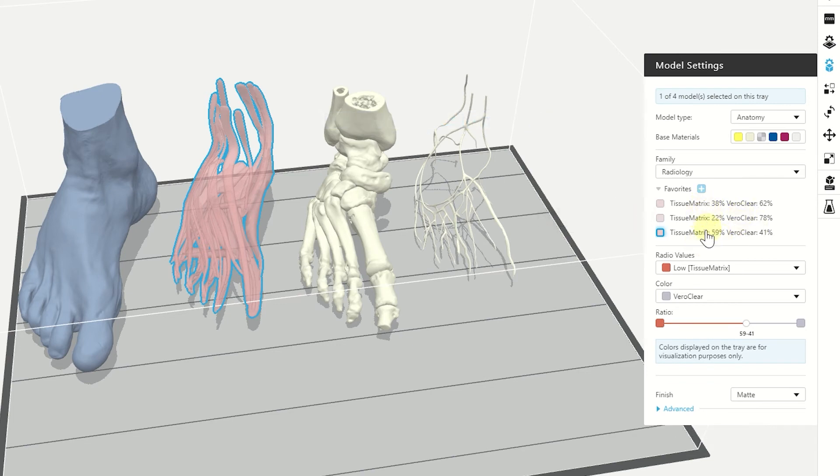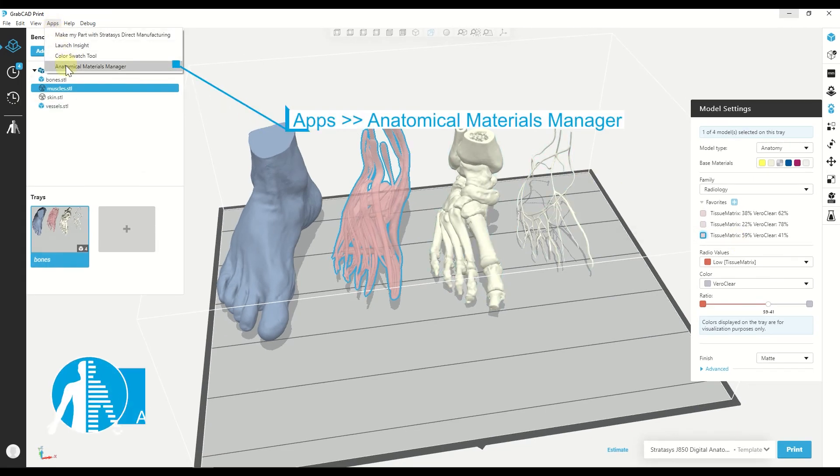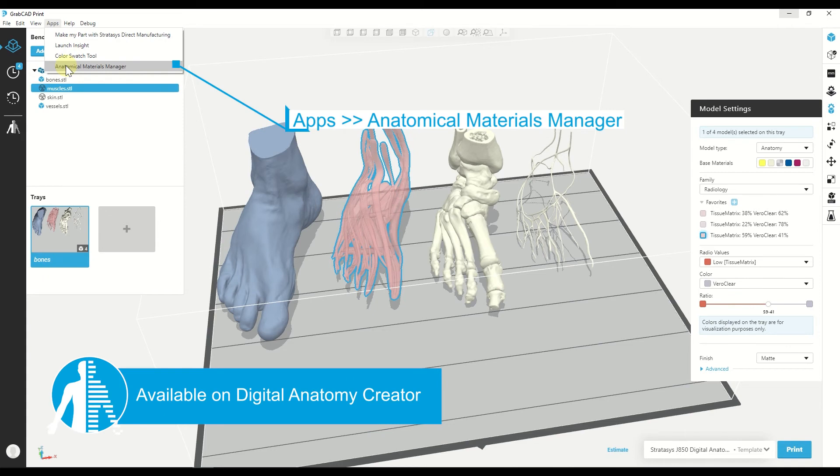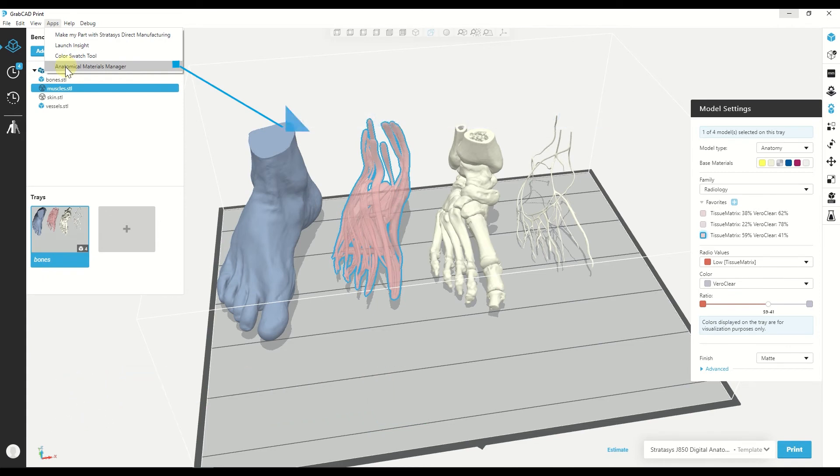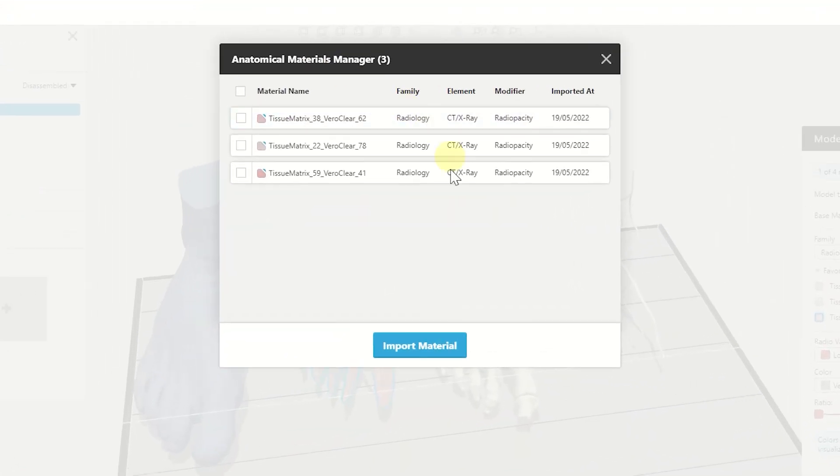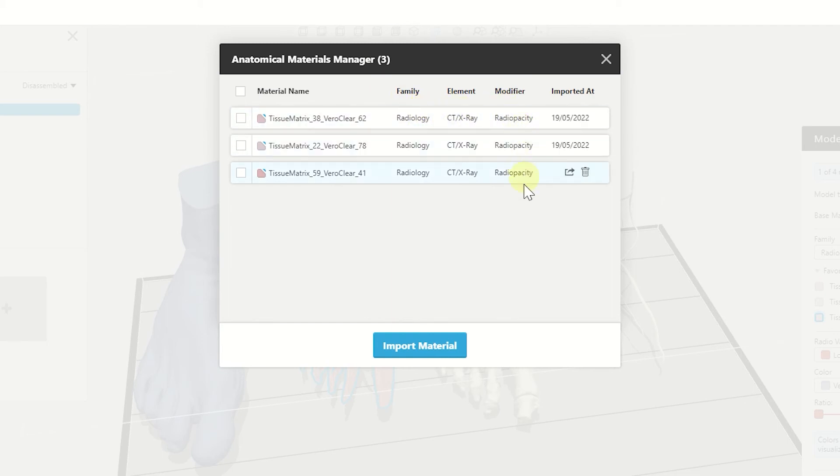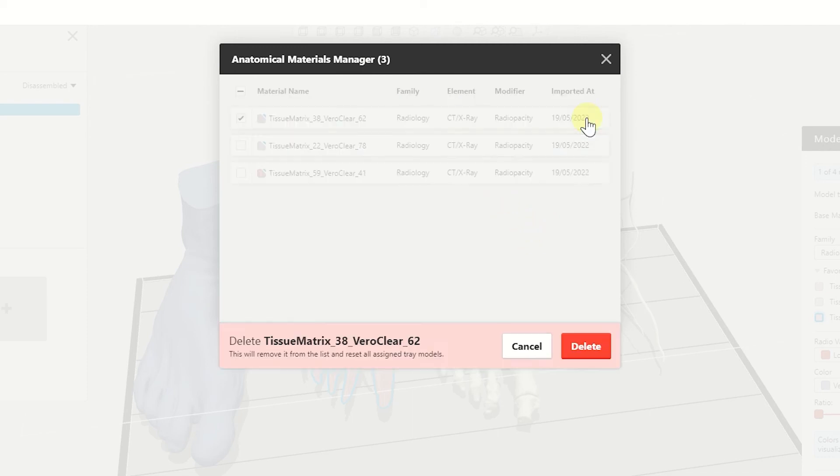These materials are saved in the anatomical material manager. So if I go to apps and click on the anatomical material manager, I can also see them in here. The name of it is the materials that I mixed and the different ratios. The family will be radiology, the element CT x-ray and the modifier is radiopacity. And from here, I can also erase one if I want to.